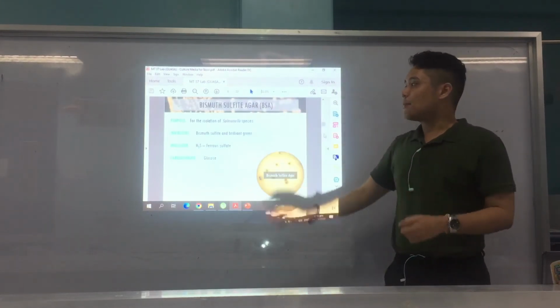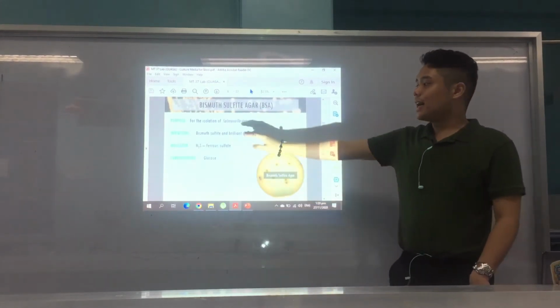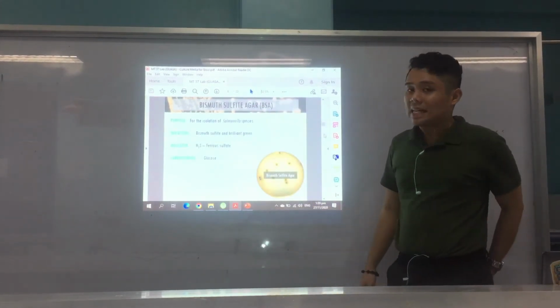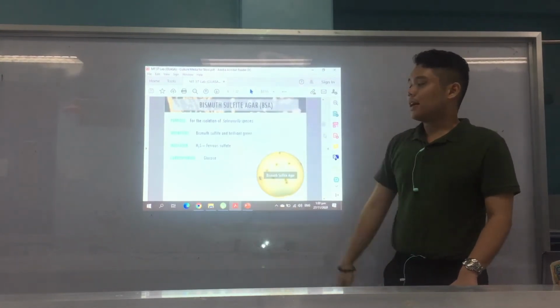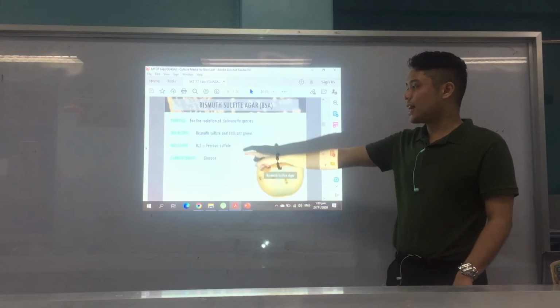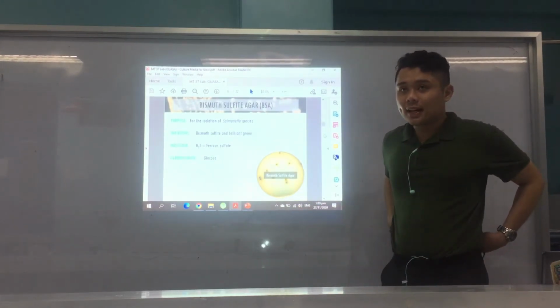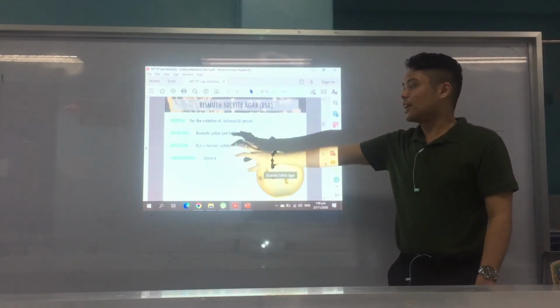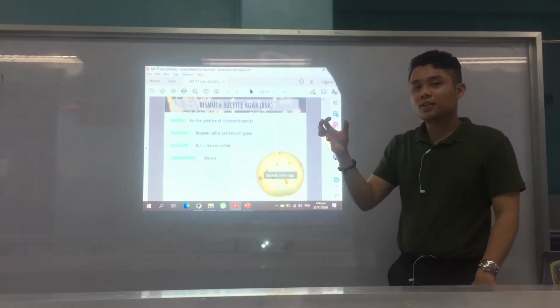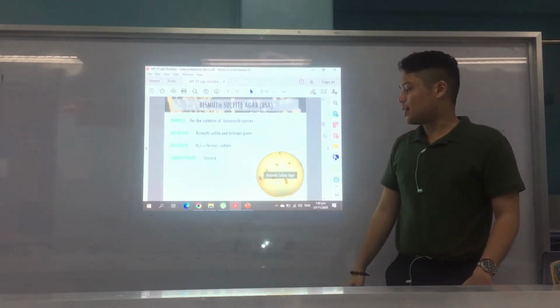Okay, and we'll start with bismuth sulfite agar. Again, isolation of Salmonella. Inhibitors: bismuth sulfite and brilliant green. These two inhibit other organisms aside from Salmonella species. And the indicator is H2S, because recall that Salmonella is an H2S producer. So the ferrous sulfate is the source of the sulfur to produce H2S. And the carbohydrate is glucose, alright?